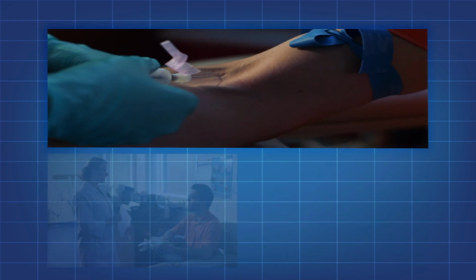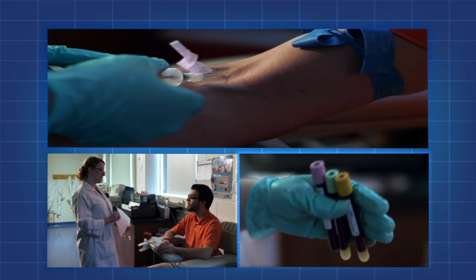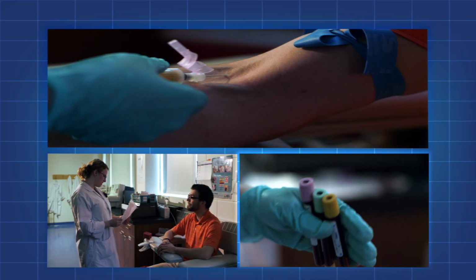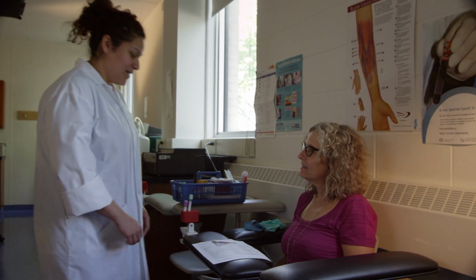Most people are familiar with the process of having blood drawn for various laboratory tests. This process is called phlebotomy. Phlebotomy may be performed by a medical laboratory technologist, a laboratory assistant, or in some cases by a nurse or physician. No matter who is performing the procedure, there are certain processes that must be followed.